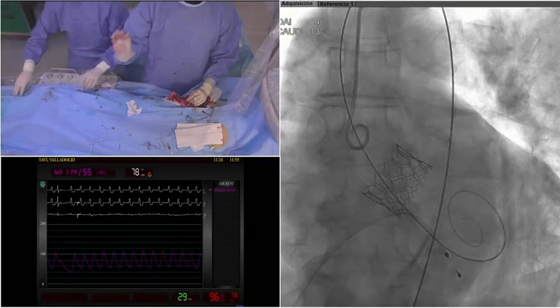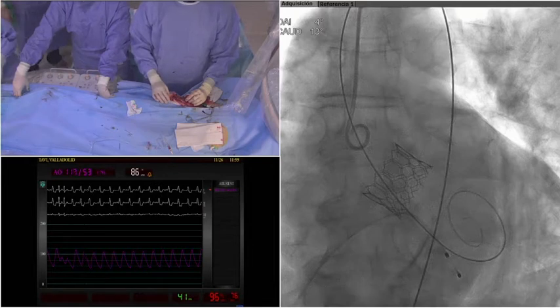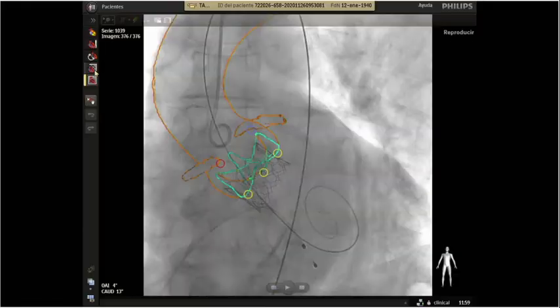You see the pressure, we are calm. We have a left bundle branch block. Maybe we were a little bit lower than what we planned initially, but you can see that even with the predilation, positioning of the prosthesis was challenging. Maybe we should have done a more aggressive one. I don't know what you think.